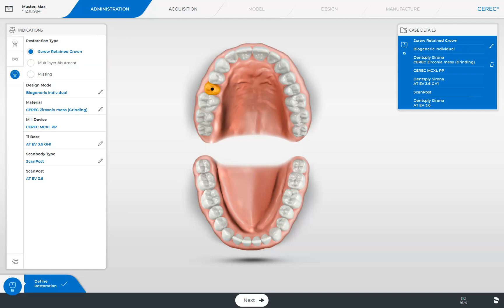You can, of course, add several or all indications to a patient case. For example, you can set up several single tooth restorations in either the same quadrant or different ones, or combine a crown with a bridge restoration. Before we finish, we would like to mention that after the complete setup of all restorations, you can also turn on the virtual articulator. This will ensure that the related dynamics will be considered for the calculation of the initial design proposal. We switch to the acquisition phase by tapping the Next button at the lower edge of the screen.